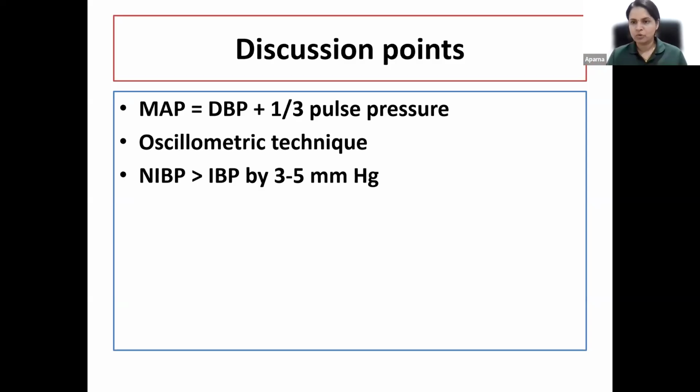Most of us know that a sphygmomanometer, which measures the blood pressure, has a bladder cuff that we encircle around the patient's arm at an appropriate measured distance. The pressure within the bladder cuff increases to a certain level wherein it initially occludes the blood flow, and then there is reappearance of pulsatility, and finally we stop hearing the Korotkoff sounds at the diastolic blood pressure. Now we measure the systolic and diastolic, and we calculate the mean arterial pressure in most of the cases.